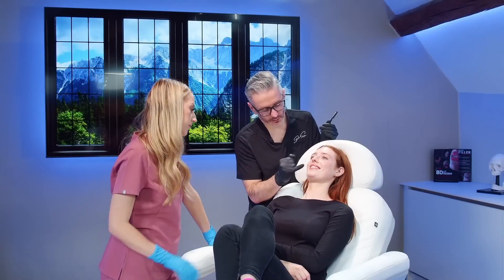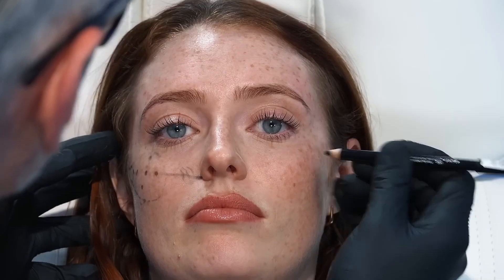When she smiles, the greatest bulk of her cheek is here, relatively on the lower side, while the upper area is much more bony and empty. This fits quite nicely with my injection pattern - injections are mainly superior. The treatment should be restorative and slightly beautifying rather than augmenting. The lateral cheek junction looks better on that side - it looks fuller. There's a slight difference to her cheeks - this might be a slightly fuller side.